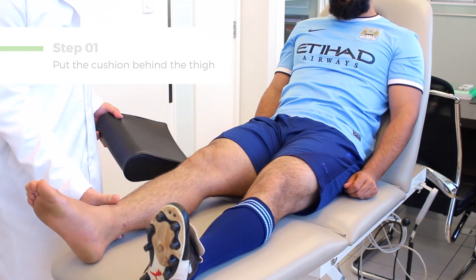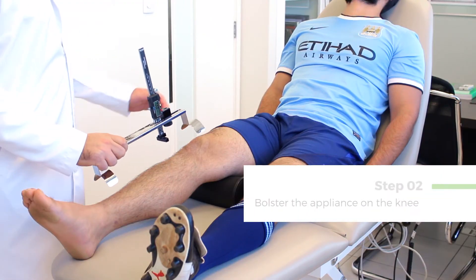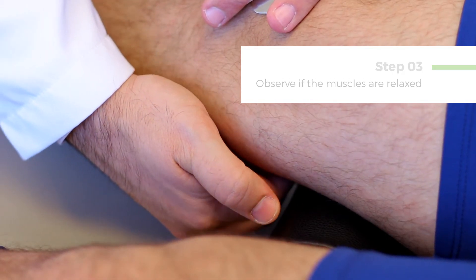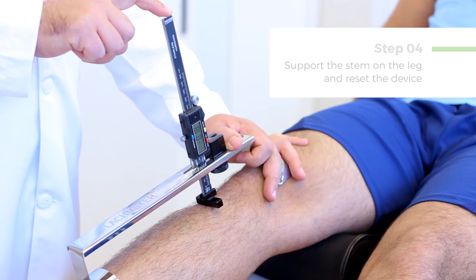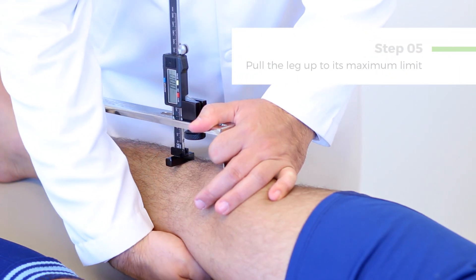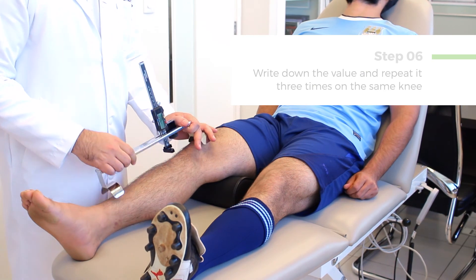Watch how it must be used. Put the cushion behind the thigh. Bolster the appliance on the knee. Observe if the muscles are relaxed. Support the stem on the leg and reset the device. Pull the leg up to its maximum limit. Write down the value and repeat it three times on the same knee.